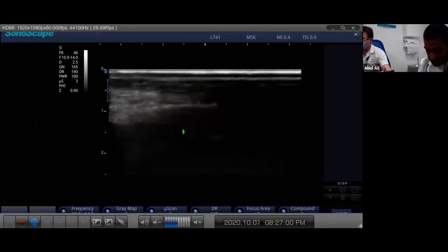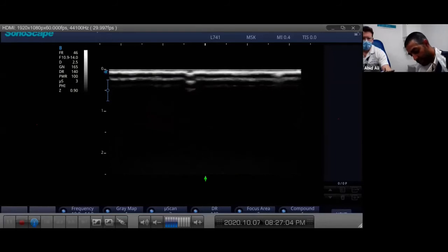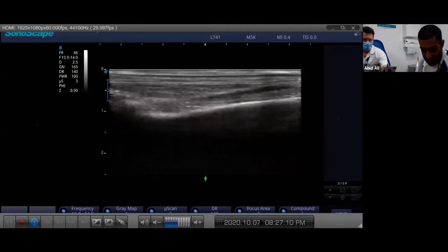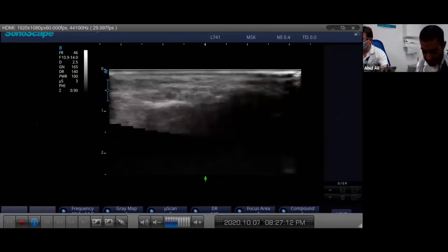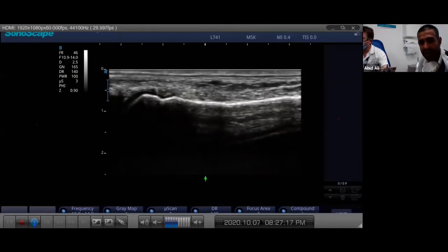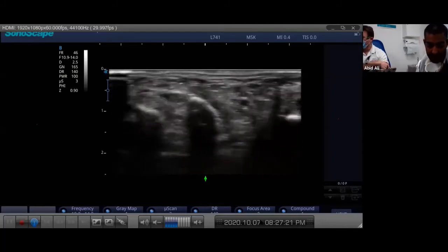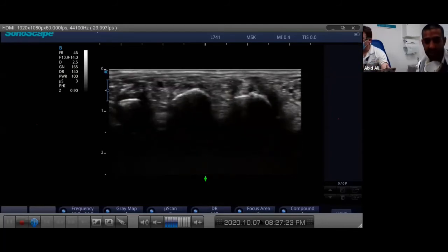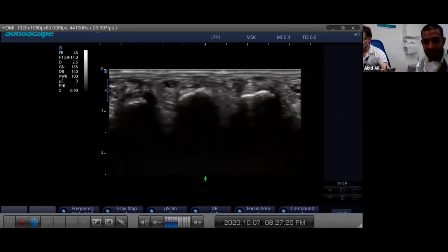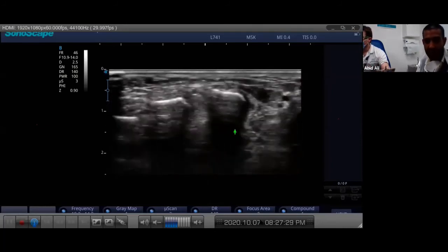So we've been very medial over the foot and we've interrogated - look how many structures we've looked at just on the medial column, or first ray as some people describe it. We haven't completed our midfoot exam - we've got to look at the next bunch of joints. Let's go now to our second toe. Pick up your second toe, flex it and move it, see if you can see the tendon. You can go straight into longitudinal axis or go to transverse and pick up all the metatarsals in one go.